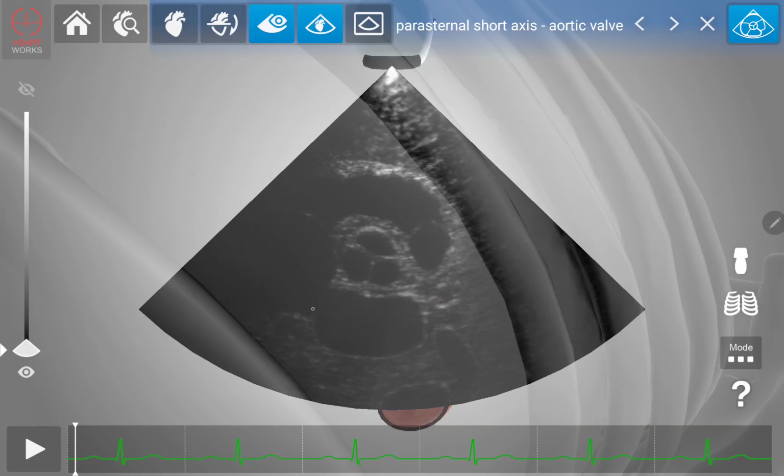I told you the intraatrial septum is contiguous with the non-coronary cusp. You know that this is the right ventricular outflow tract and right ventricle, so that's going to make that the right coronary cusp. And then this is going to be your left. Okay? So non, right, left. Again, basic anatomy, something that you should be familiar with, something that's going to help you build into that advanced critical care echo examination.